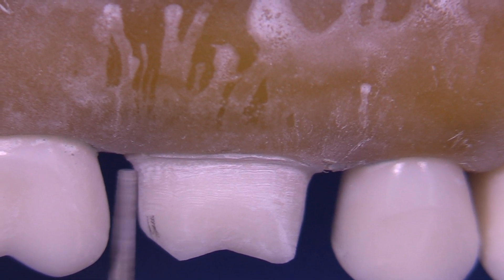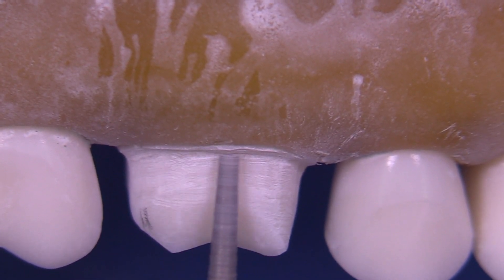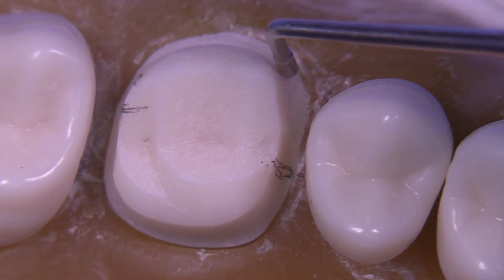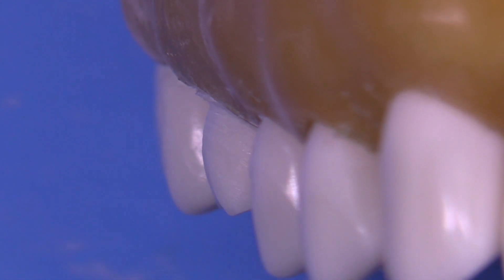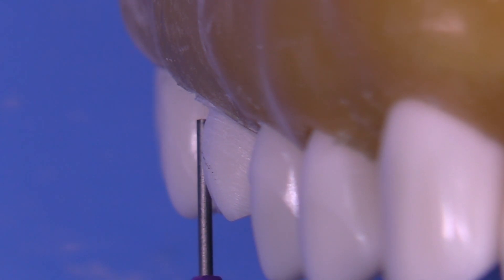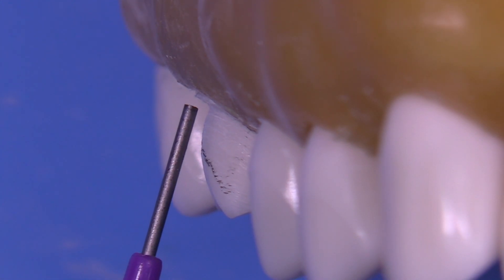Typically we like to have the finish line location about 0.2 to 0.5 millimeters supragingival — it might even be almost at the tissue level, but you don't want to go below. You can use the RGS3, which is one millimeter wide, to verify you're accomplishing this requirement. Notice that you create a huge undercut and bulge on the facial when focusing on the shoulder, because the shoulder has to be 90 degrees relative to the root surface area below it — so you will create this undercut area, and that's not a problem.